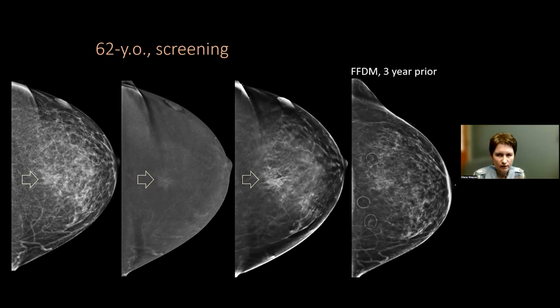However, looking back on her prior 2D mammograms, she always had some kind of asymmetry there. There is no prior DBT to compare the distortion part of it, but the asymmetry has been there for several years at least. But now we know that there is a distortion, there is enhancement, so we are definitely concerned about it.